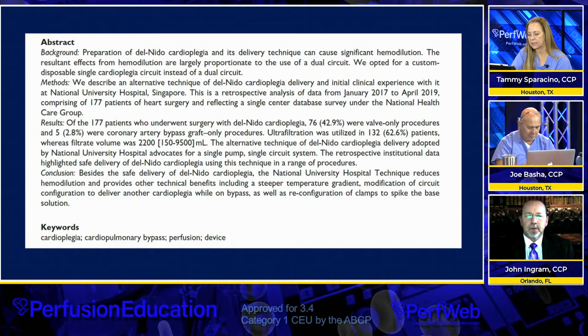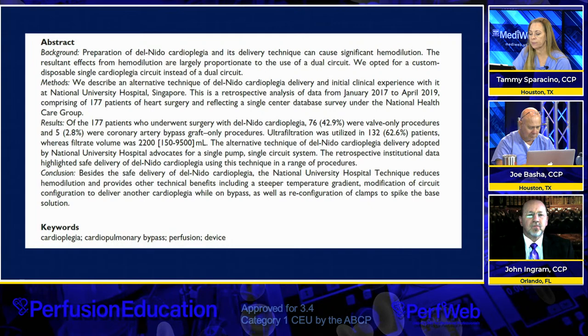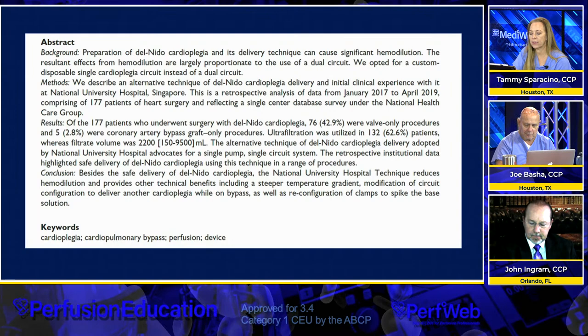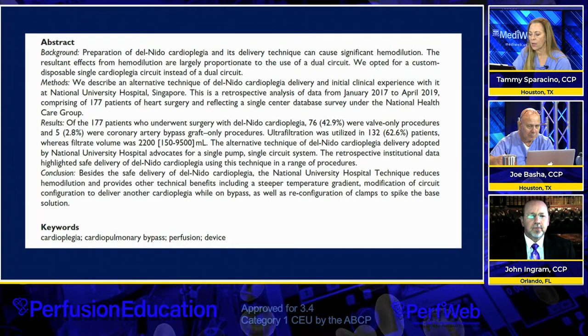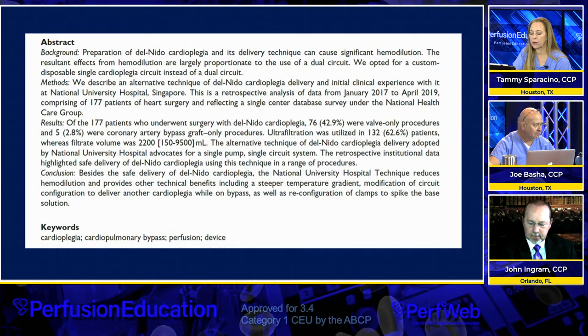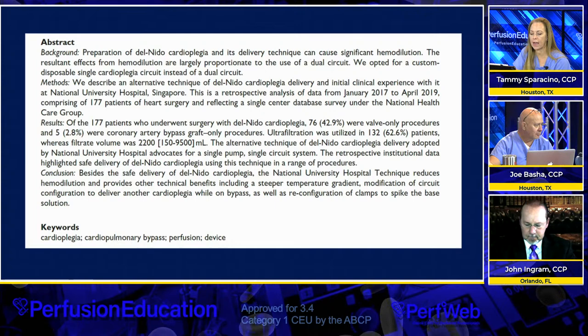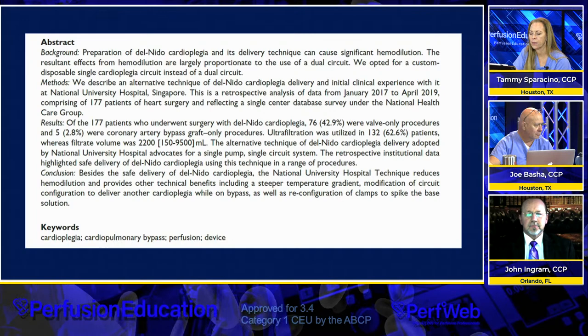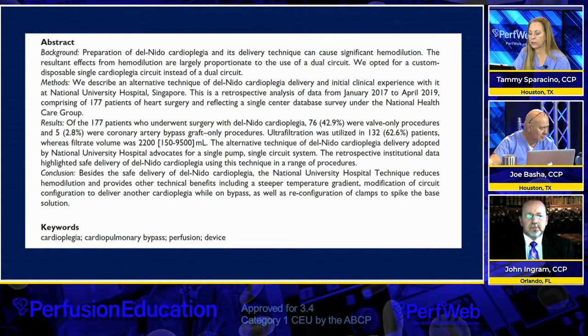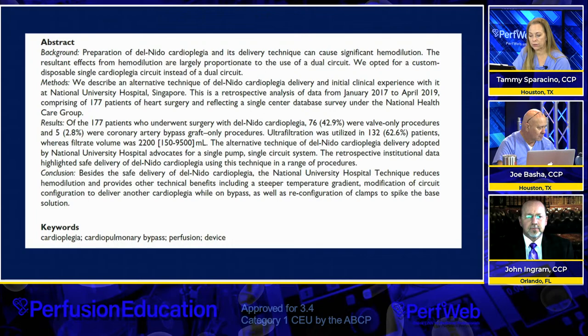They had a decent size population that they looked at. It's a retrospective study of 177 patients who underwent cardiac surgery with del-Nido cardioplegia. 76 of them were valve only, 5 were coronary artery bypass grafts only. They looked at ultrafiltration utilization, which was 132 patients, about 63%, and their filtrate volume was just over 2 liters. The alternative technique of del-Nido cardioplegia delivery was adopted by their institution, which is National University Hospital, abbreviated as NUH moving forward. And they advocate for a single pump, single circuit system. The institutional data was highlighted for safe delivery of del-Nido using this technique in a range of procedures. And we'll get to the conclusion a little bit more as we go.